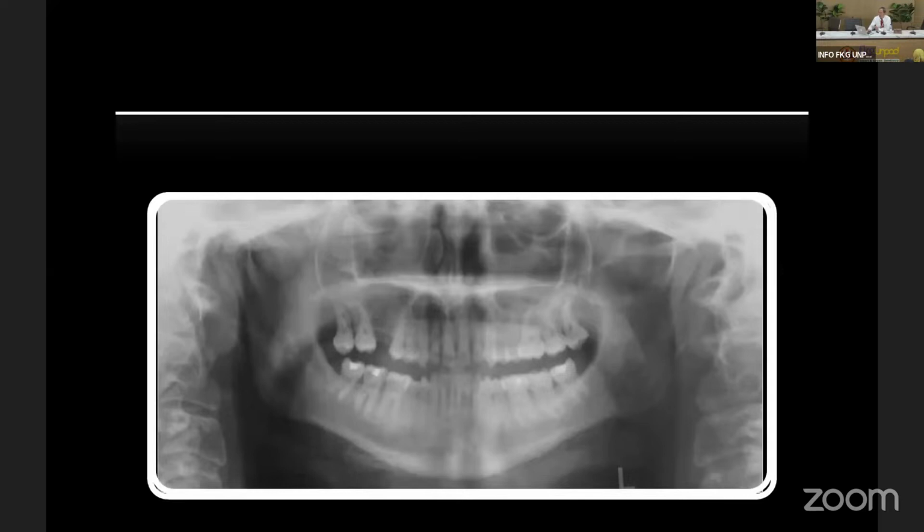We can see if we look at the border of the maxillary sinus, the left side is intact. The right side depends on the light; with this kind of light, maybe it's hard for you to see any change. Also there's no caries lesion, and the bone level is fine. The only thing is that this third molar is somewhat resorbed in the distal.